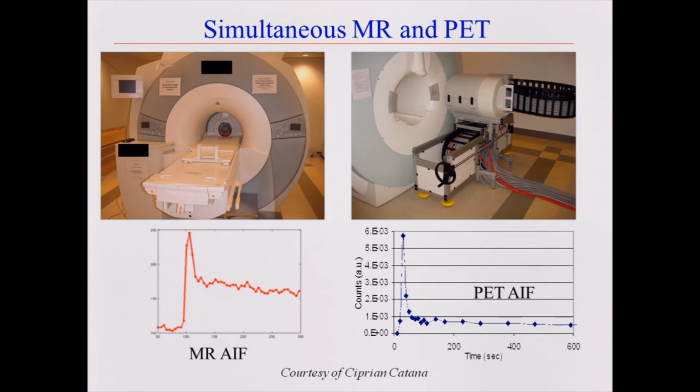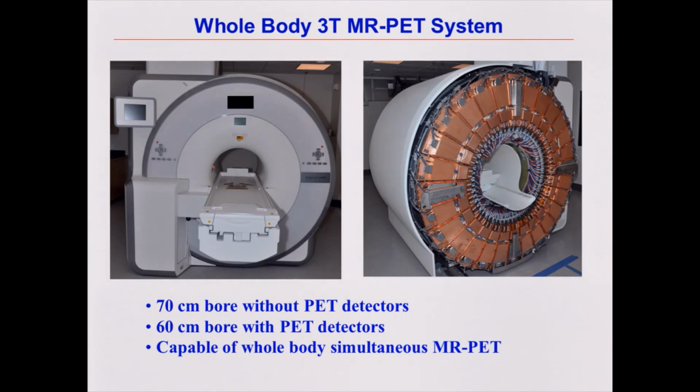We're over here interested in imaging the heart, so this PET head insert is limited, but there now are whole body systems that are commercially available where PET and MRI of the heart can be performed simultaneously.